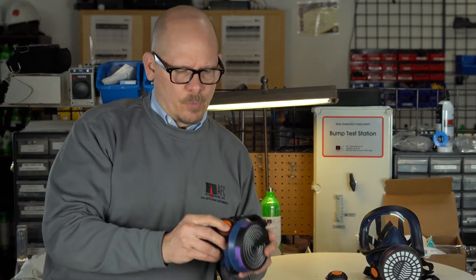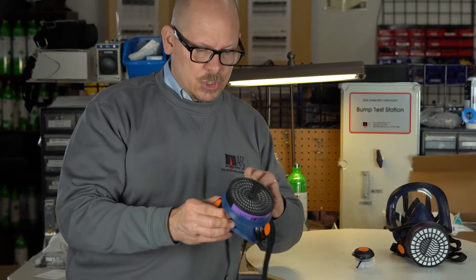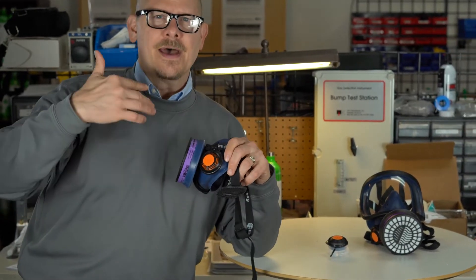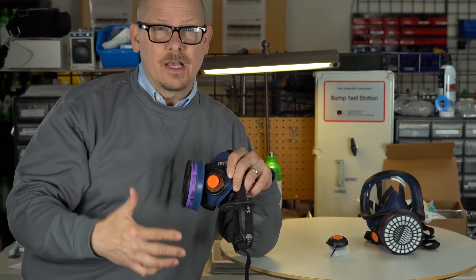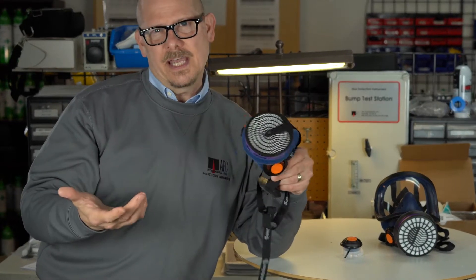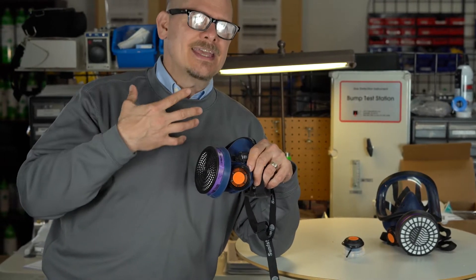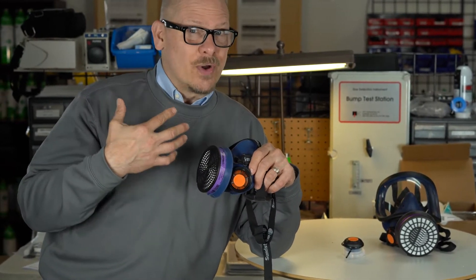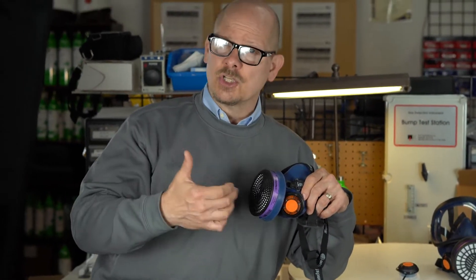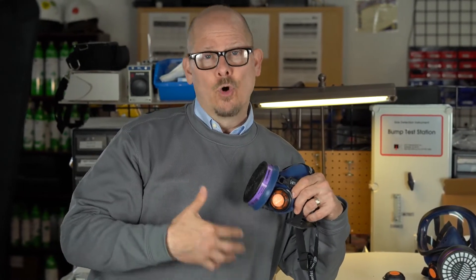Sundstrom is known for being one of the only — I think maybe only one — that actually has two exhalation valves. I've done studies showing that by having two exhalation valves, the breathing resistance as you exhale is cut in half. It's incredibly important to know that breathing in takes some effort, but exhaling out takes a lot of effort too. If you only have one exhalation valve, Sundstrom has done studies showing it can take a lot out of you over time.